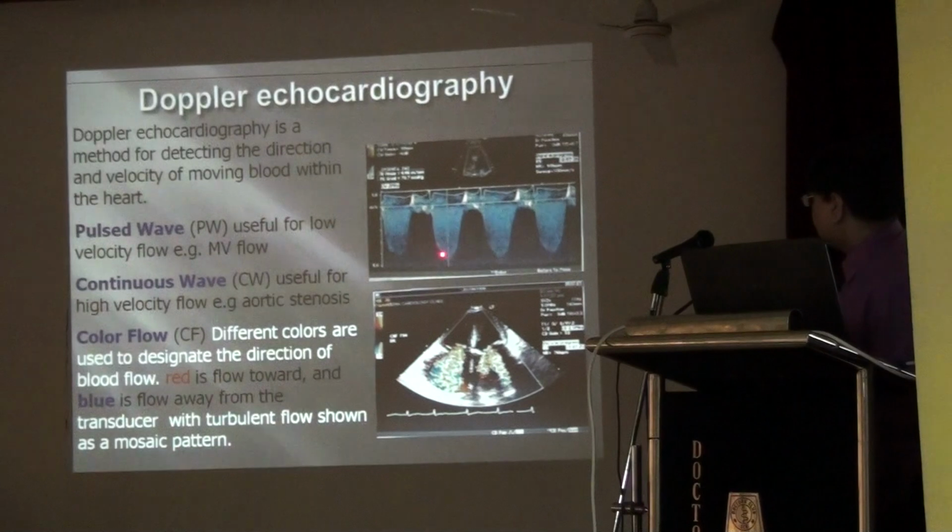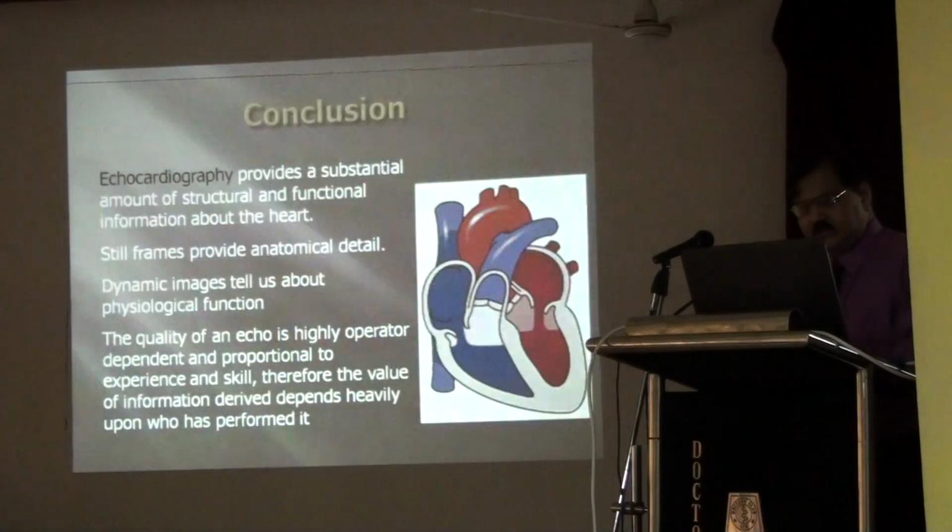Similarly, there is the Doppler calculation of regurgitation velocity, in systole and diastole. We calculate it, and it is very important for the pressure gradient, because the whole practice now depends on the PG, how much the pressure gradient is, the outcome, the prognosis, and treatment options.